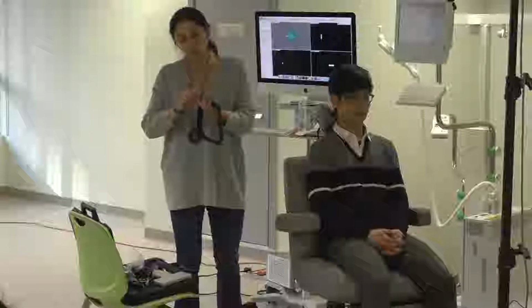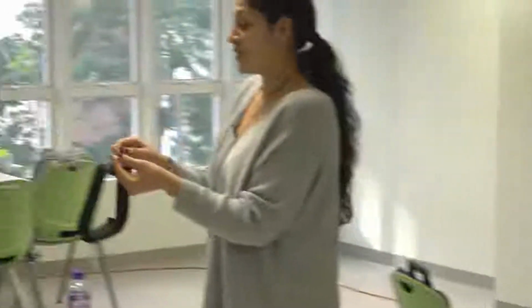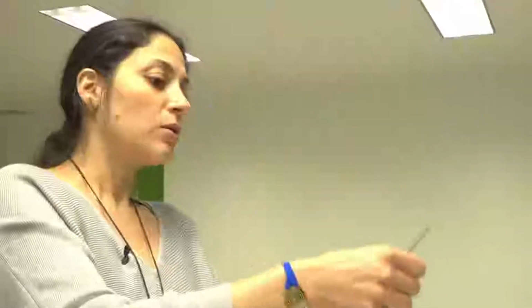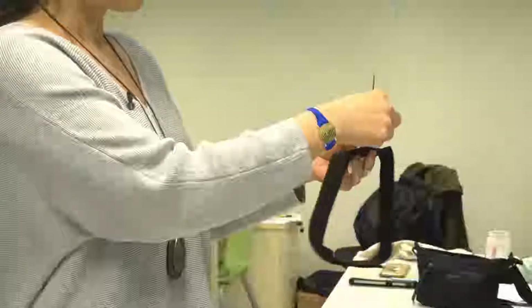This is really practical. You're just going to see silly stuff, but you have to check it. Here, you see it has a hole, and this is this bar here. You want to put it there so you are able to put the sensor, right? I'm going to test it.